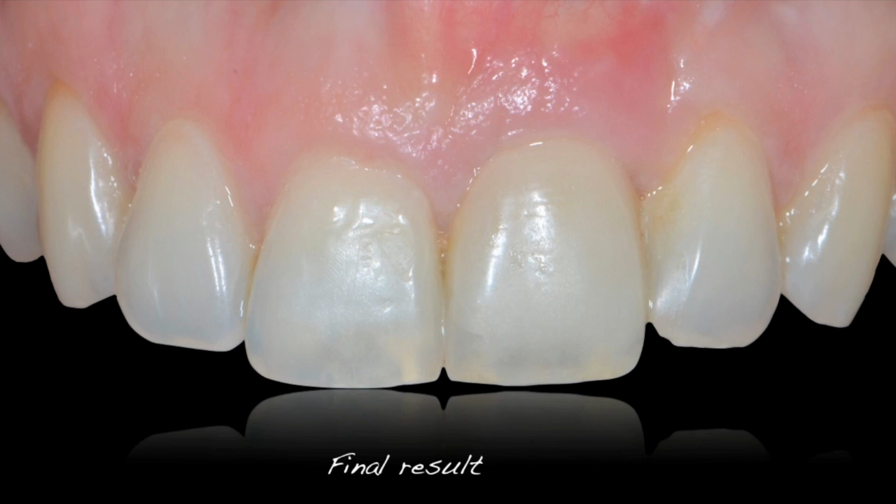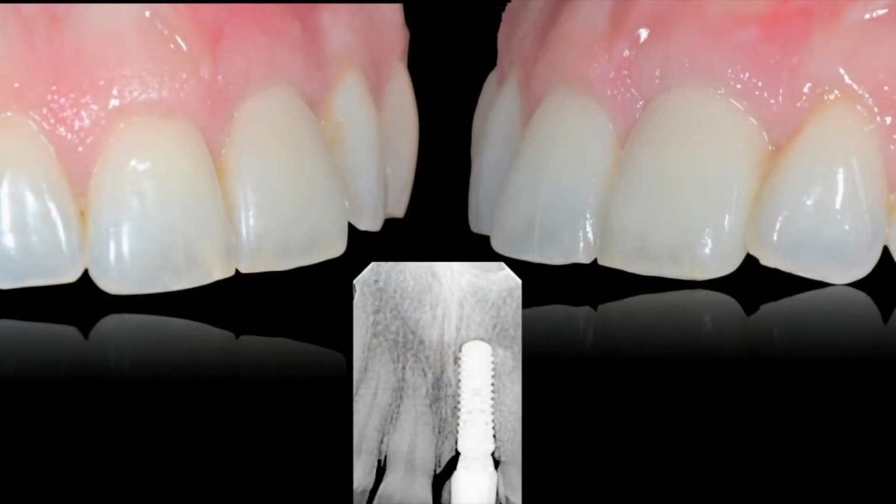This is a side shot of the same final result with a great tissue blend, a great adaptation of the papillas, and the color, both pink and white aesthetic scores are great in this case. And the radiograph showing perfect integration of the implant and a perfect emergence of the crown.